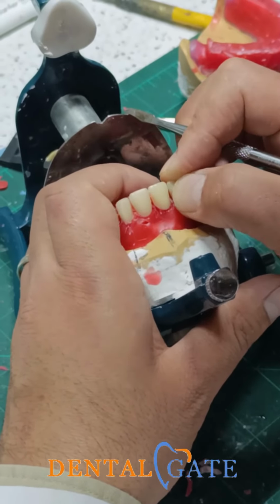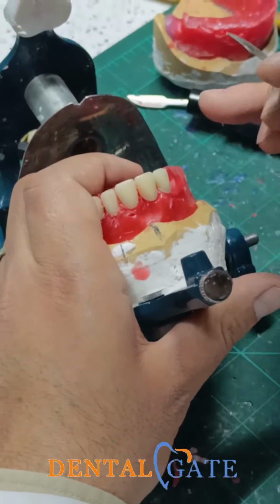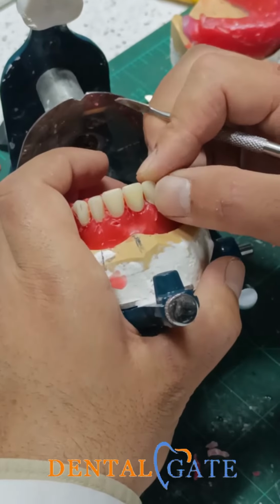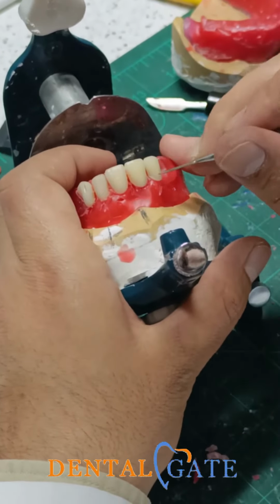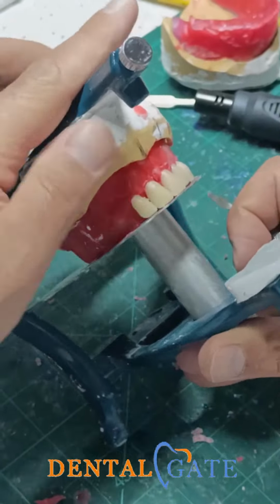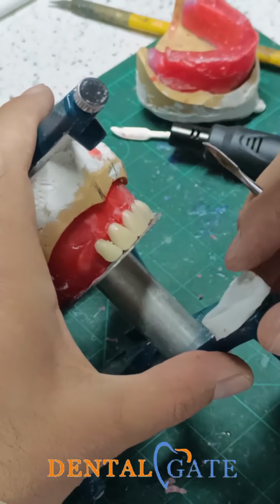So I will make a contact according to the maximum coverage of the proximal surfaces. So regarding the inclination, my recommendation, don't make any inclination now. Instead of that, just put it in the vertical axis. Okay? So make a check for the space. You need only 0.5. Don't make it severe.